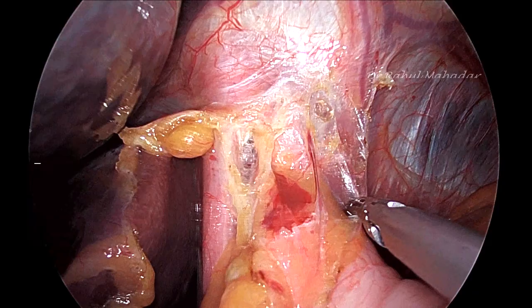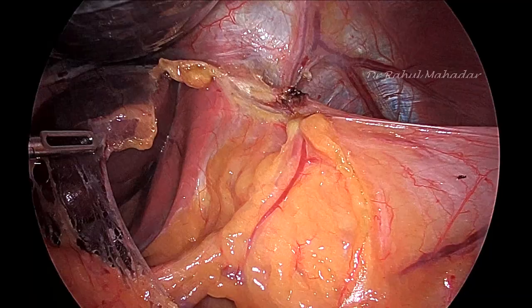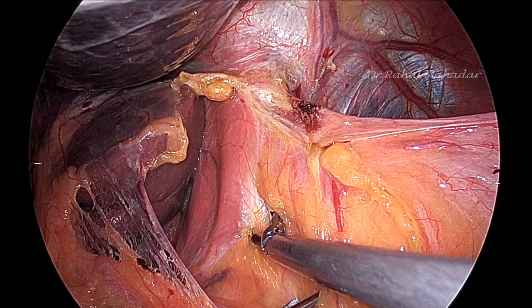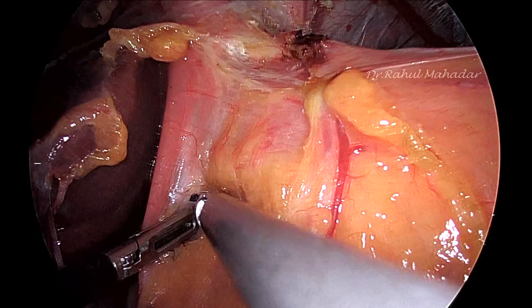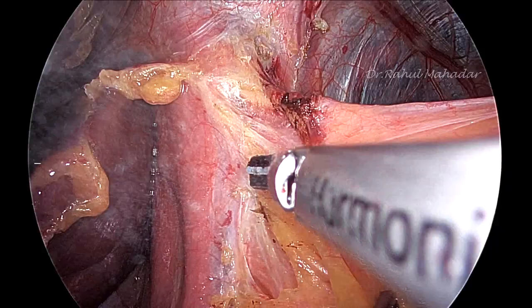Simultaneously hemostasis is achieved. Then ask the assistant to give a little traction and you can see very well the peritoneal lining over the right crus. At this line, you take a small incision with the help of a harmonic scalpel and you will enter into the plane where you can preserve the peritoneum over the right crus.